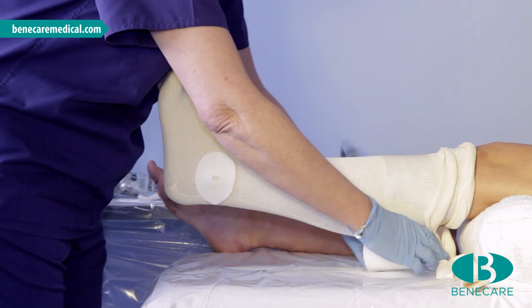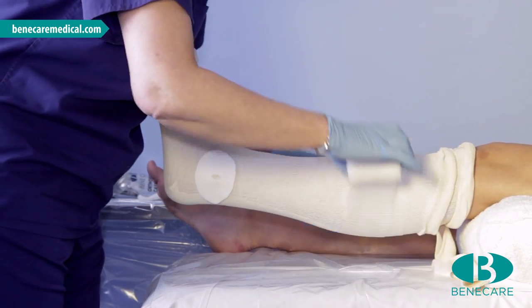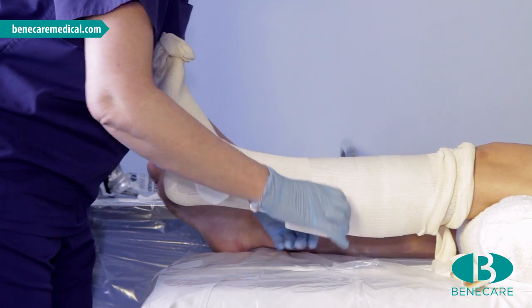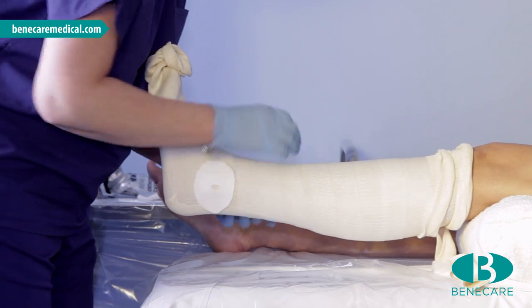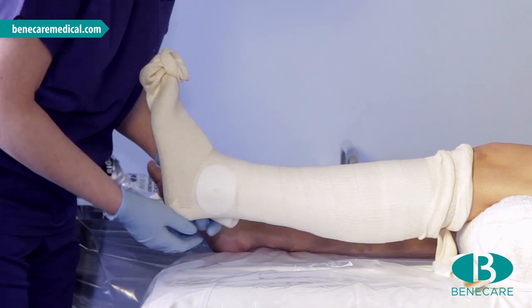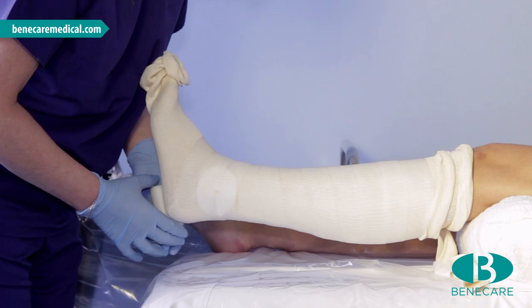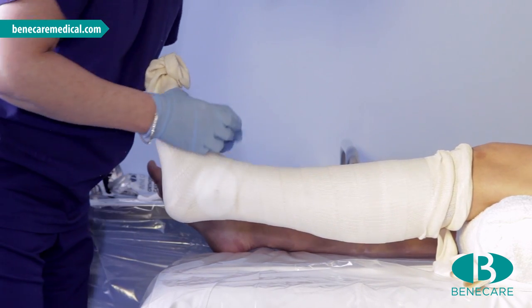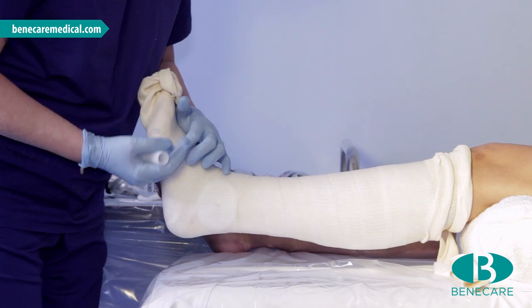Starting at the proximal end, cover approximately 50% of the previous turn, working from one end of the limb to the other using very slight tension, keeping the roll very close to the limb to give even pressure. Come below the first metatarsal head, catching the fifth metatarsal.